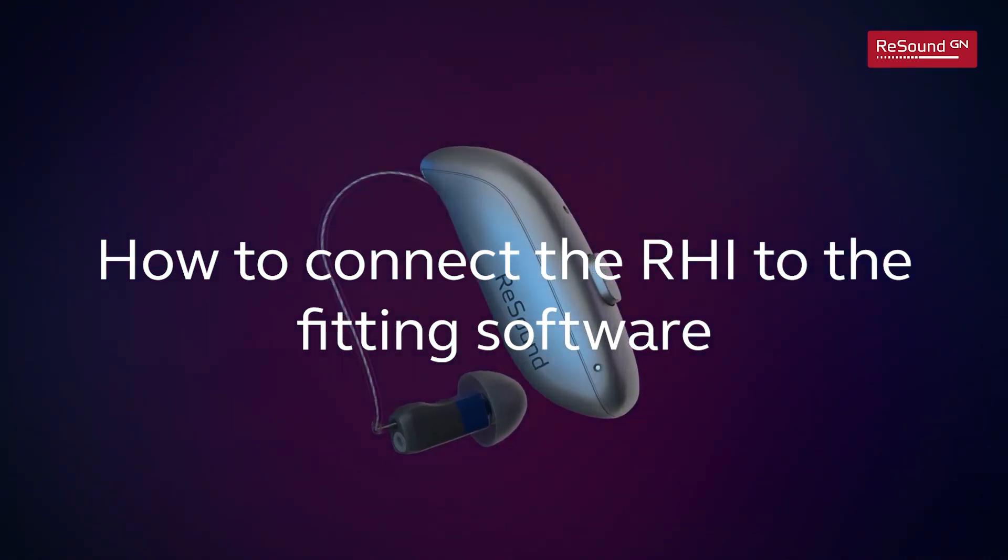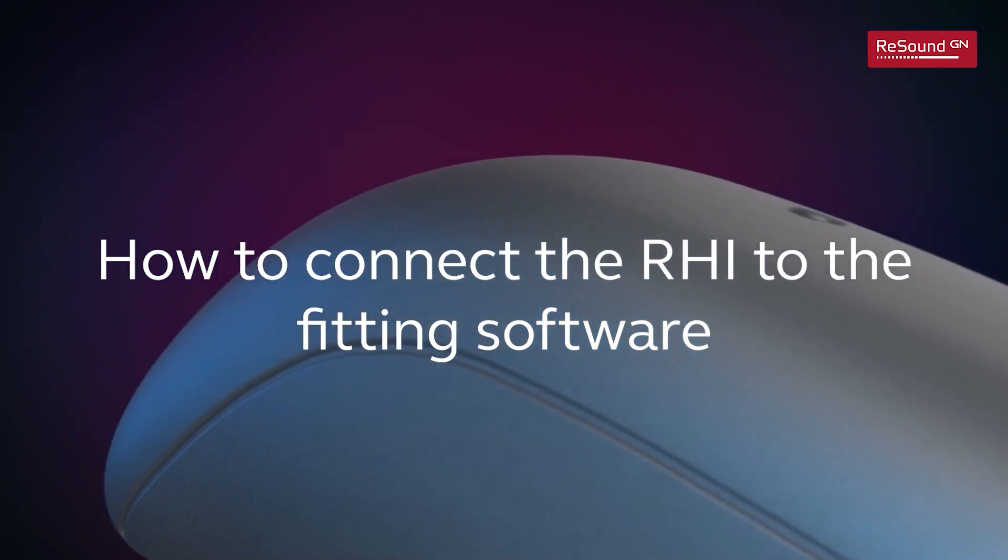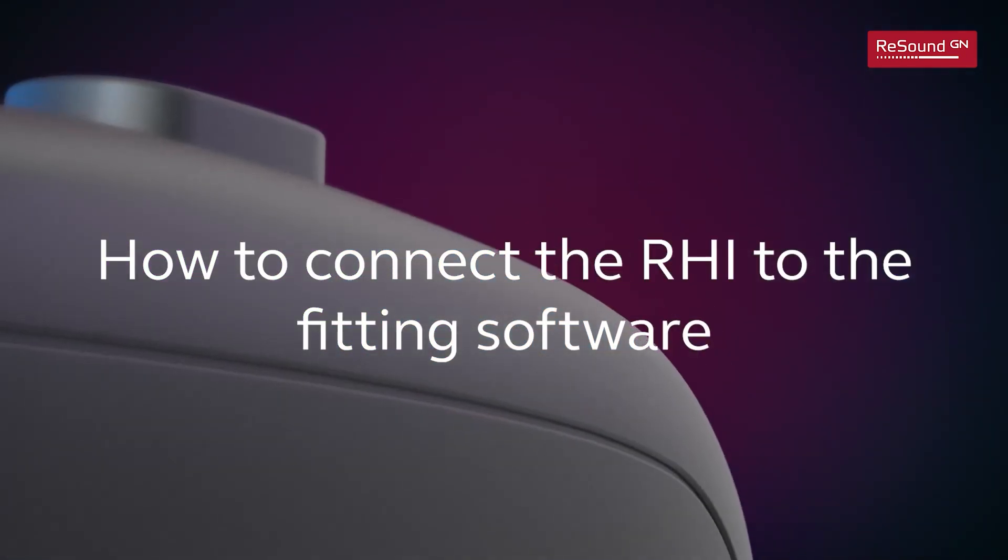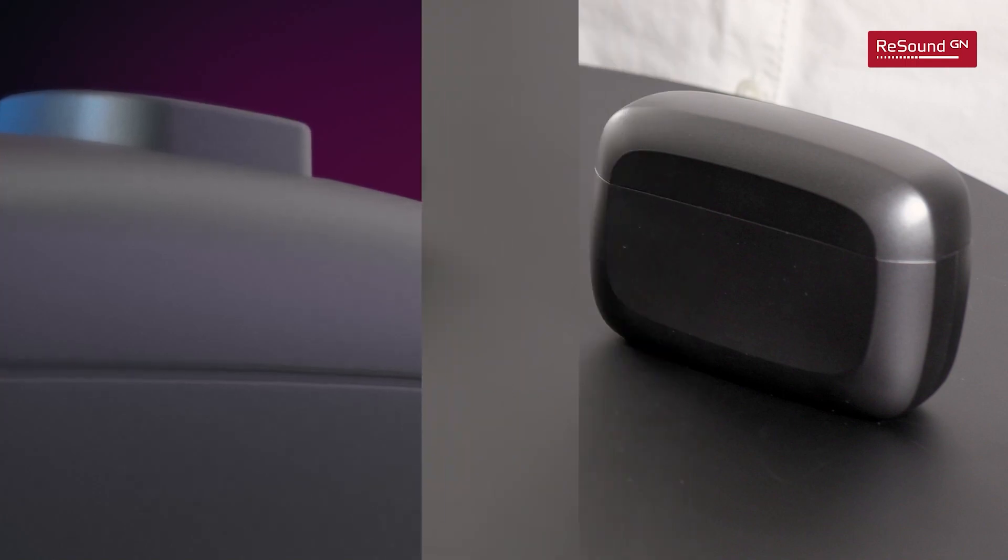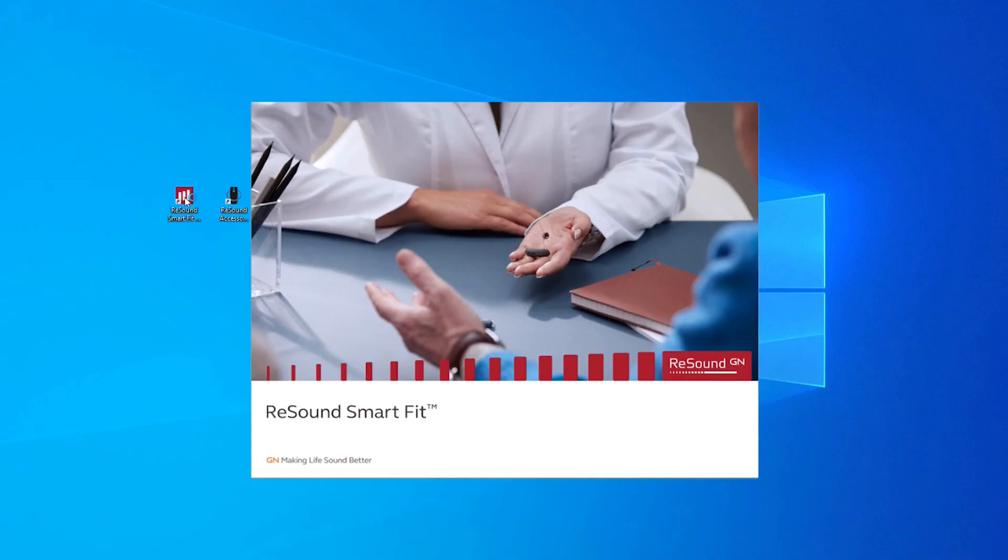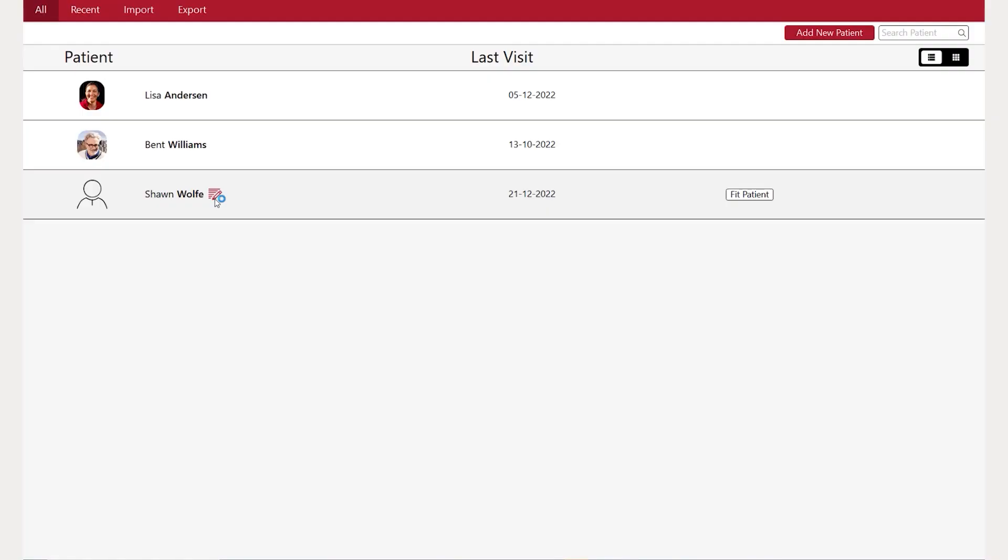How to connect the rechargeable hearing instrument to the fitting software. Launch ReSound SmartFit.